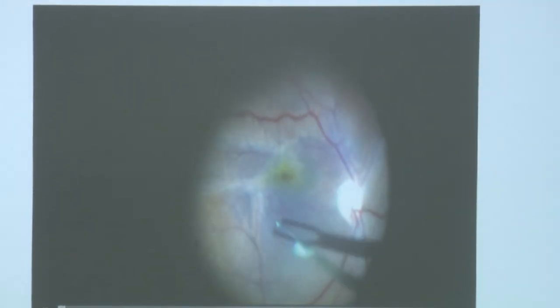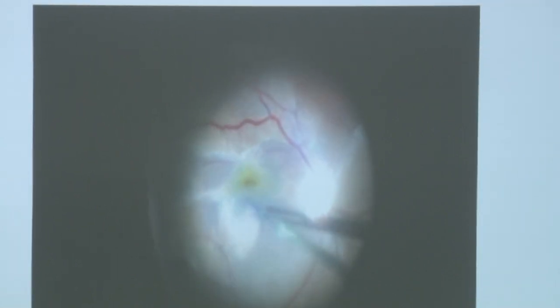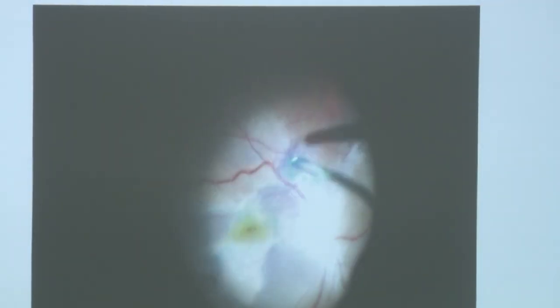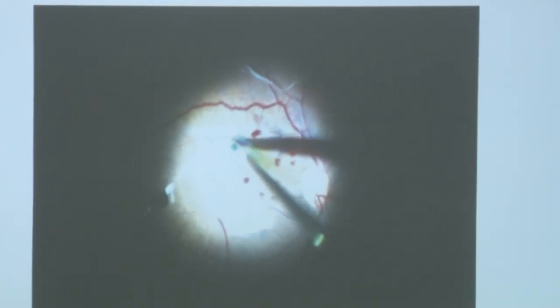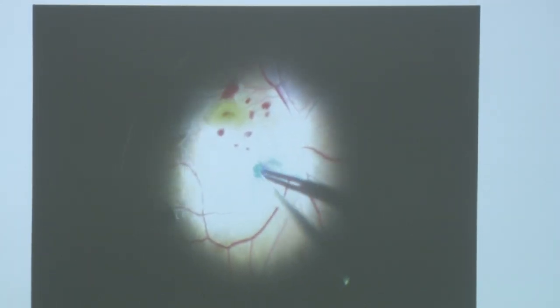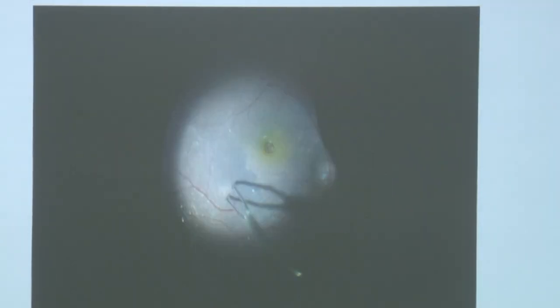This is a case of idiopathic epiretinal membrane. Such cases are not very difficult to peel because once we get an edge of the ERM, generally it comes off in a sheet. However, tough membranes definitely need multiple patchy peeling. Sometimes if we get an edge of the ILM, it can come along with the ILM, so we can remove ILM and ERM in one go. These cases are also well handled with a micro-incision vitrectomy system.